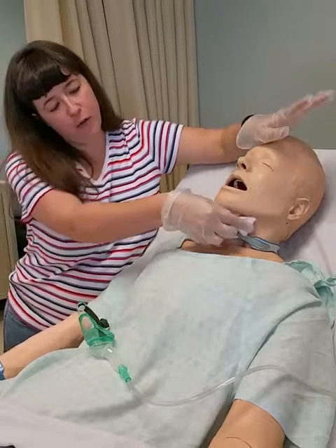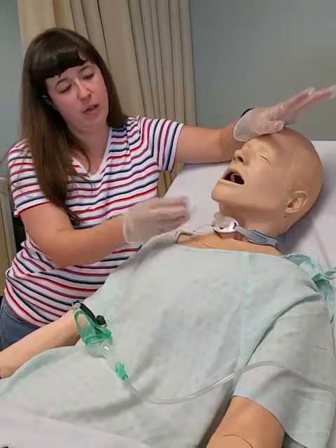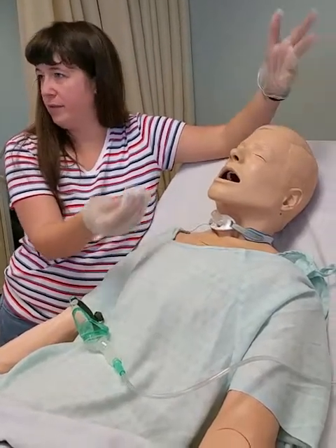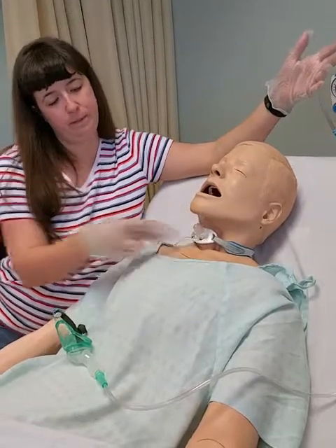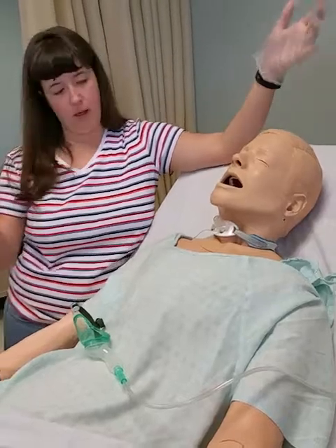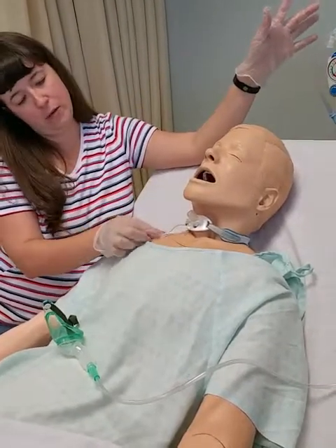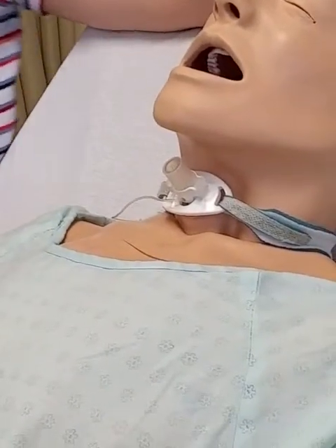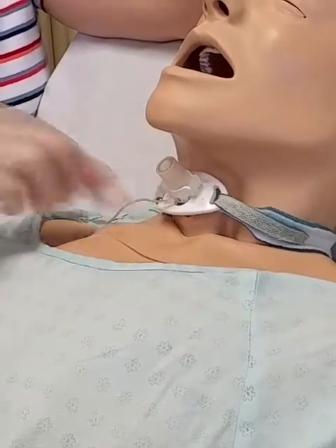So now I'm going to go further out around the skin, making sure that I clean up the faceplate because this is probably going to have some secretions on it as well. So I'm going to clean all that up. That goes in the garbage. Now I'm going to come back with my saline. So I'm going to take my saline Q-tip, making sure I'm rinsing all the hydrogen peroxide off. Garbage. My saline gauze, same idea.